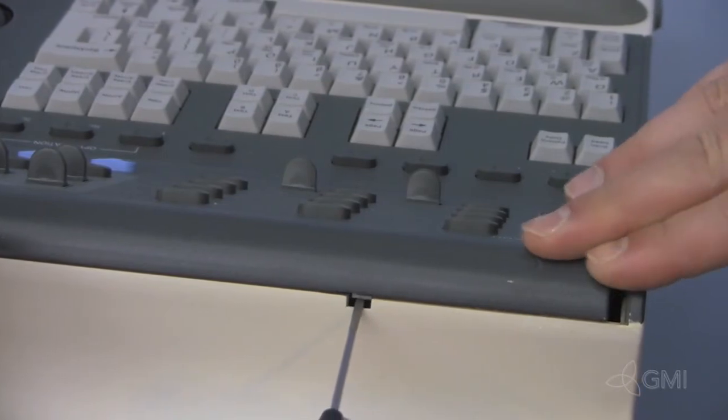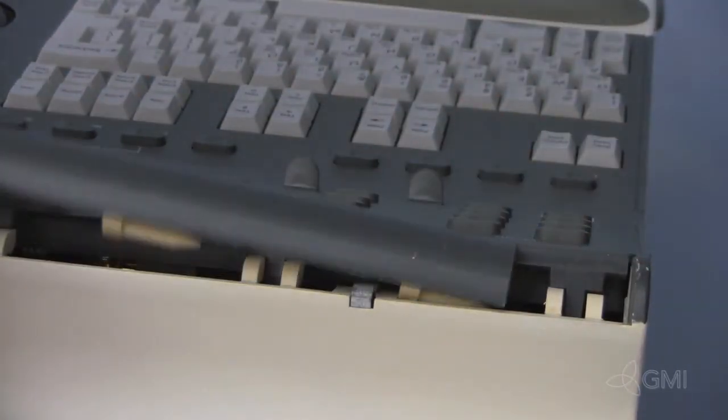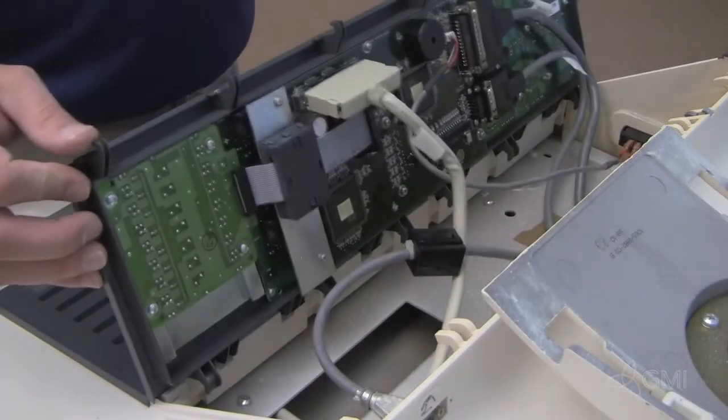Insert a small screwdriver in the retaining slot and slide the UILock to the right. Lift and remove. Tilt the upper UI towards you.